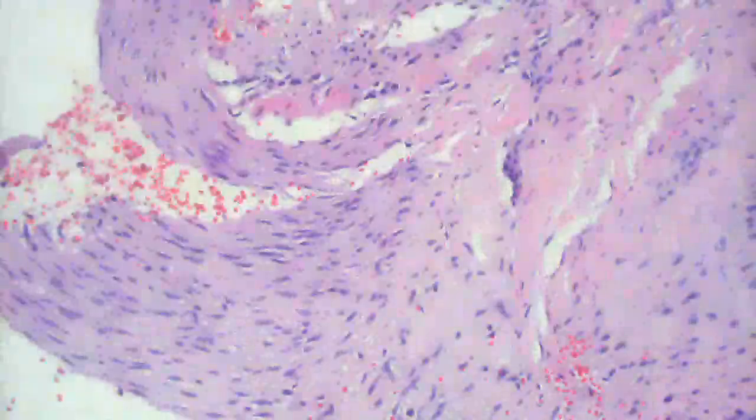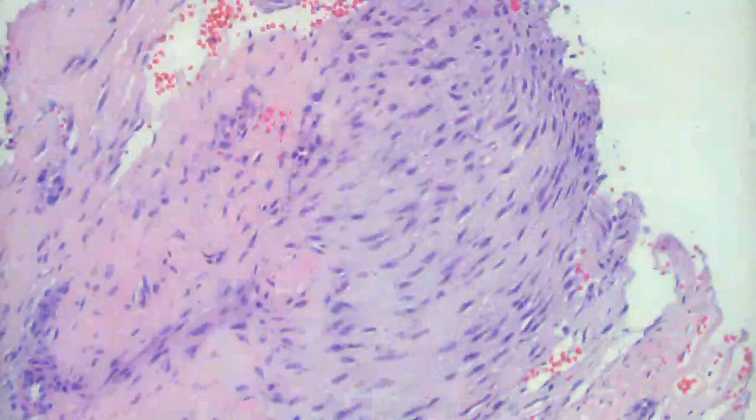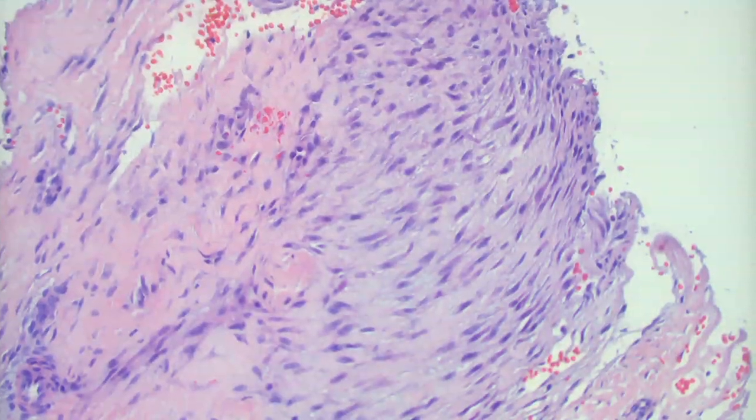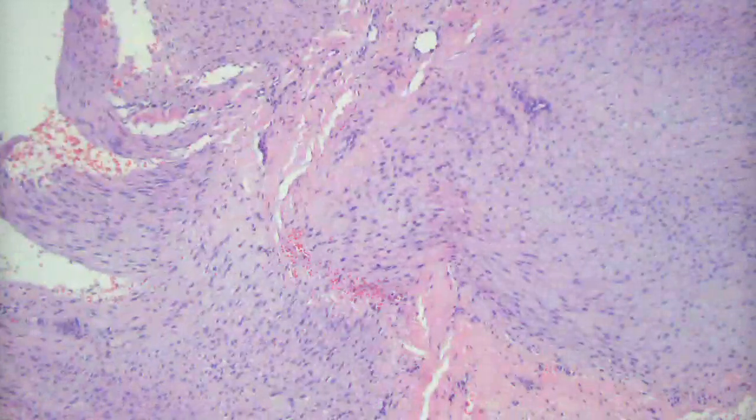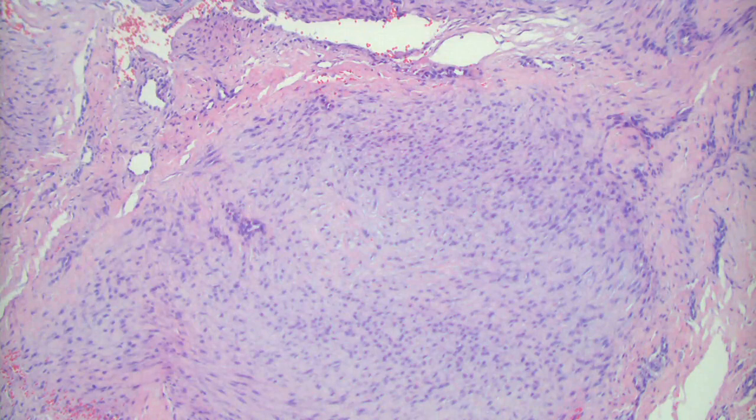Did you like benign or malignant? Benign. Good, benign. So what's the most likely diagnosis? Nodular fasciitis. Yeah, or what kind of category does nodular fasciitis fit into? What family of entities is nodular fasciitis part of? Like the myofibroblast? It is a myofibroblastic proliferation, you're right, but there's kind of a family of disorders in that same category of nodular fasciitis.